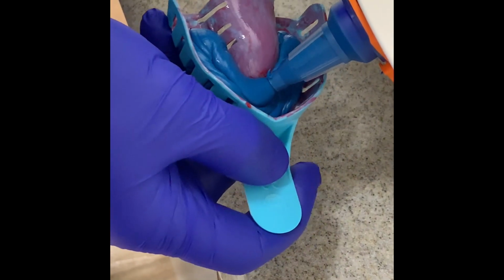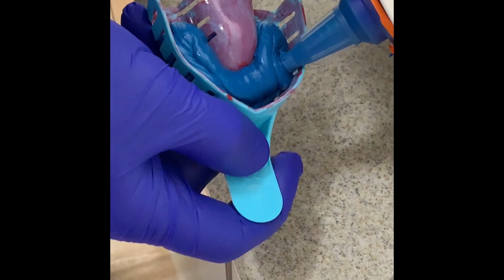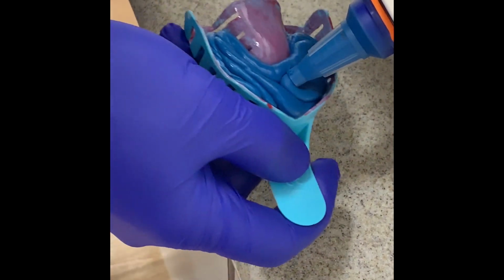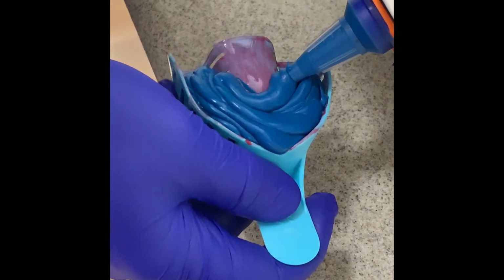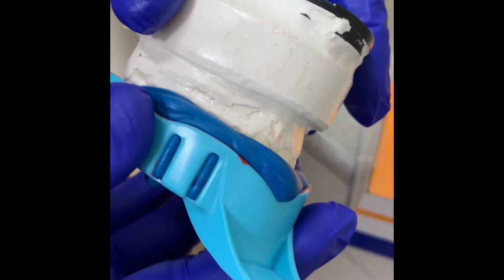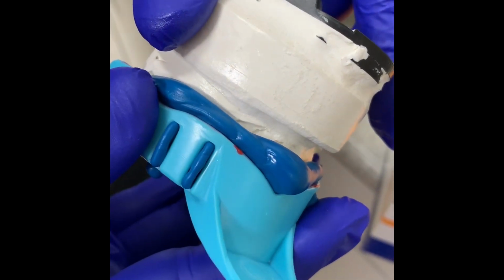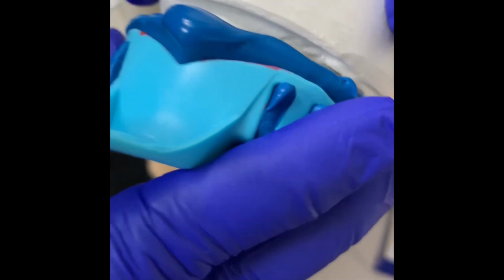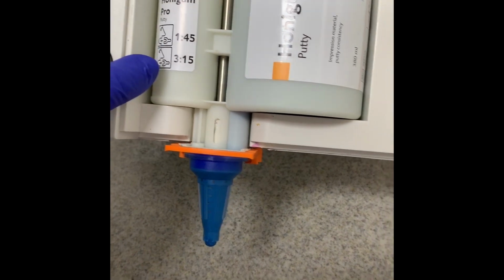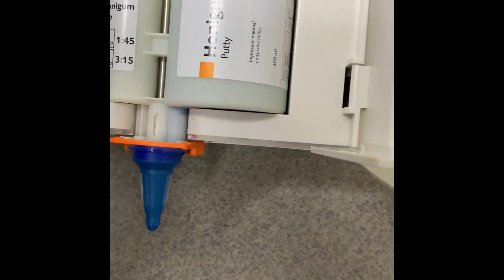Now you just want to capture at least one or two teeth behind what you're going to be fabricating your temporaries from. So in this case, it's teeth 5 through 12. We're going to gently seat our tray in there. One of the nice things about this putty is that the set times are on here: a 1 minute 45 second working time and a 3 minute 15 second set time. So we'll let this set, and then we'll be back in a minute.